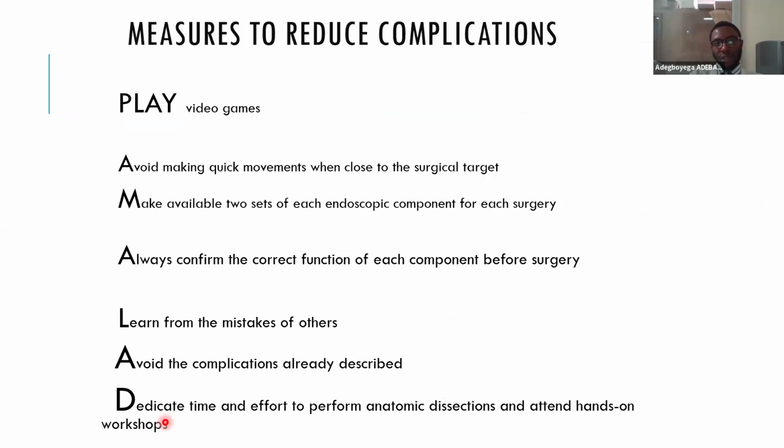What are the recommendations to reduce complications of neuroendoscopy? It's advised that the surgeon should play video games. This is because playing of video games improves eye-hand coordination, which is an essential skill for neuroendoscopy.